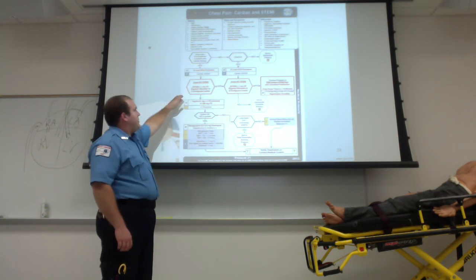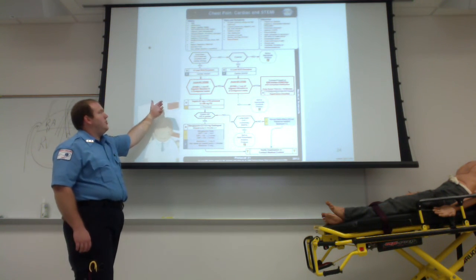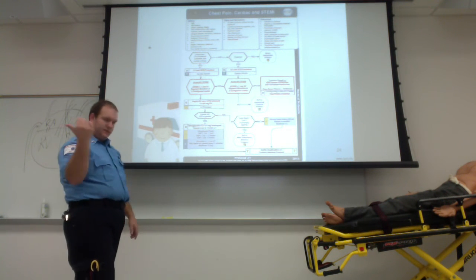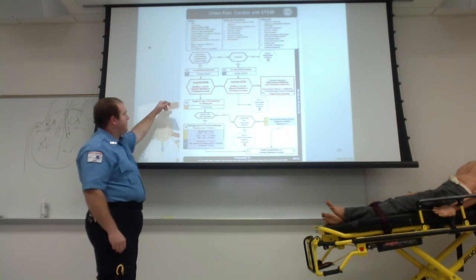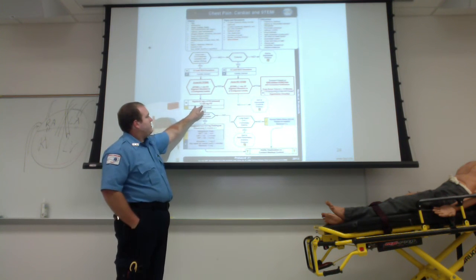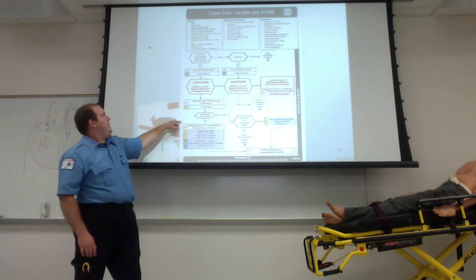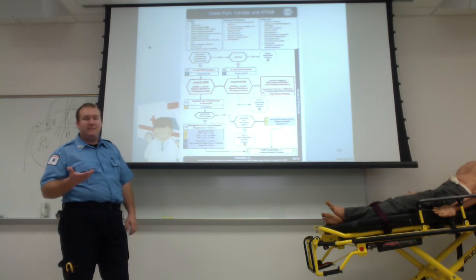Acute MI, STEMI, maybe you'll have trouble seeing it. STEMI is equal to or greater than 1 millimeter of ST segment elevation in 2 contiguous leads. If they have that, we're going to the STEMI protocol and following the rest of the protocol all the way through. And even if they have that, now we're going to give aspirin, which they can chew up, and at the intermediate level, you're going to go ahead and start an IV. Basics, don't worry about the IV. You can go on down to nitro. That is your next medication to give.